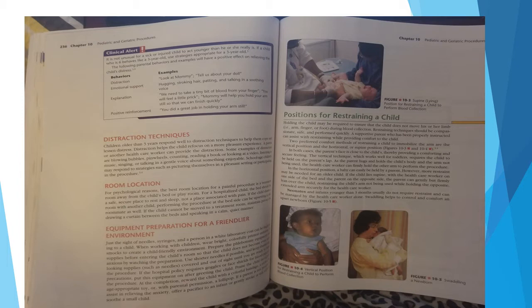Equipment preparation for a friendlier environment. Just the sight of needles, syringes, and a person in a white laboratory coat can be frightening to a child. When working with children, wear bright, colorfully printed uniforms or smocks to create a child-friendly environment. Prepare the phlebotomy equipment and supplies before entering the child's room, so that the child does not become even more anxious by watching the preparation. Use shorter needles if possible, and keep threatening-looking supplies such as needles covered and out of sight until you are ready to begin the procedure. If the hospital policy requires goggles or face shields for blood exposure precautions, put the equipment on after greeting the child.